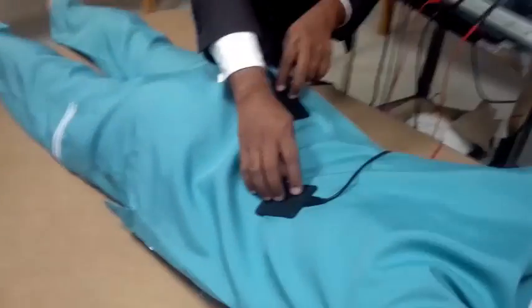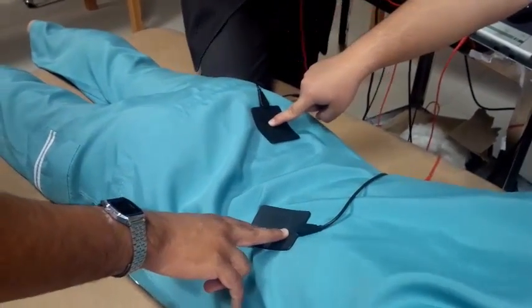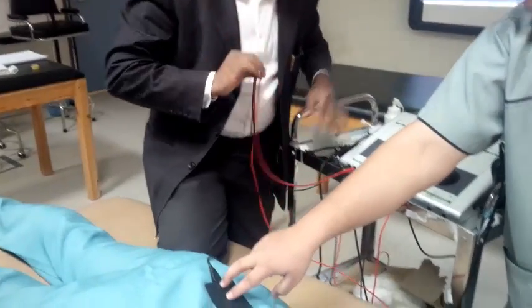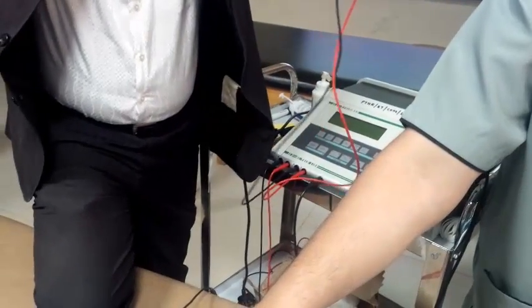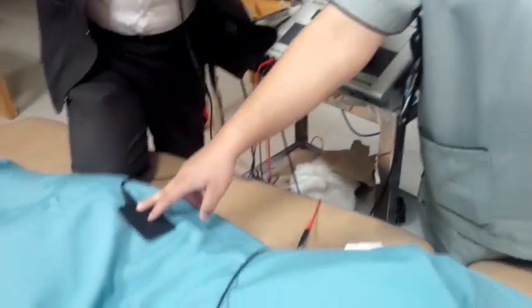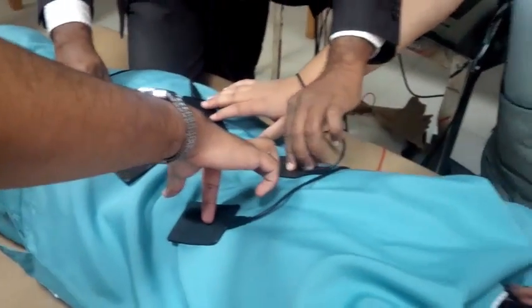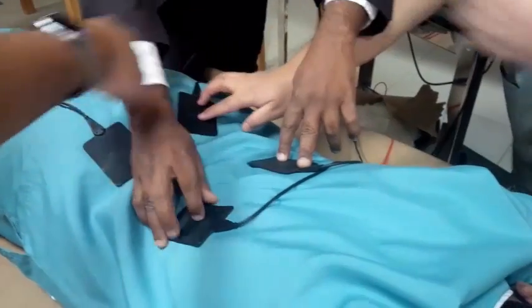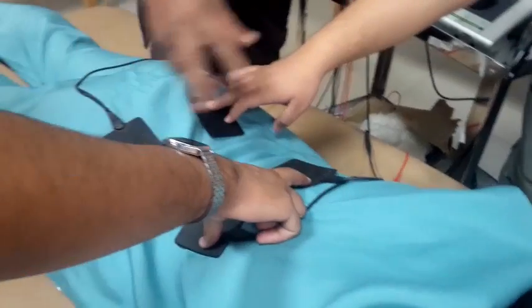Hold it one. So this is from the channel 1, you can see here. And now I am taking the channel 2 leads and I am trying to place the red one on the other side and the black one on the other side. So you should put black, black, red. Yes, exactly. Okay. So the arrangement will be like this.